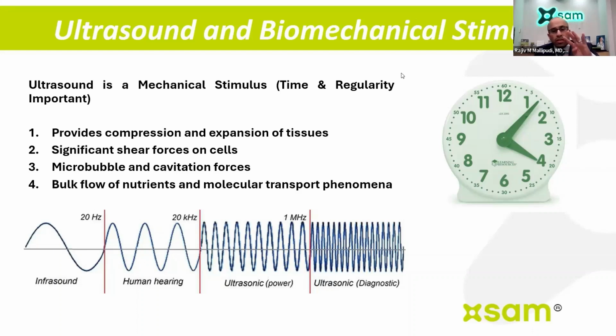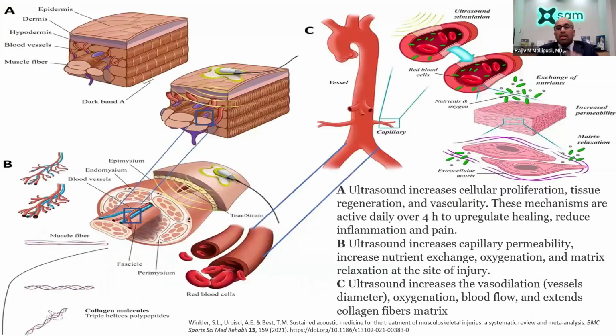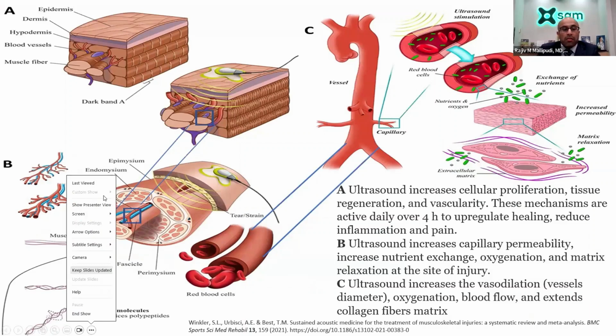So with these four different aspects, now you could get thermal benefits of heat, but also the compressive force, the shear force, the microbubbling cavitation releasing heat, and the bulk flow all working on a physiological level to enhance the recovery process. And in turn, we can divide up how it's working on the body in three different ways. As you can see from this slide, when the ultrasound is placed right on the skin, that transducer is able to provide more vascularity to be applied. Again, it's pushing that ultrasound through to the soft tissue.